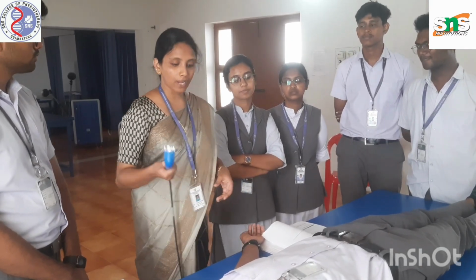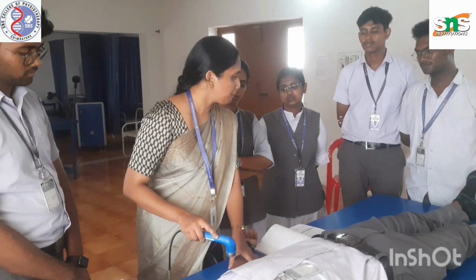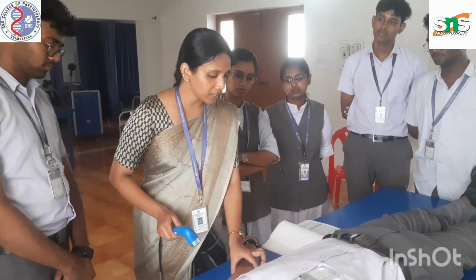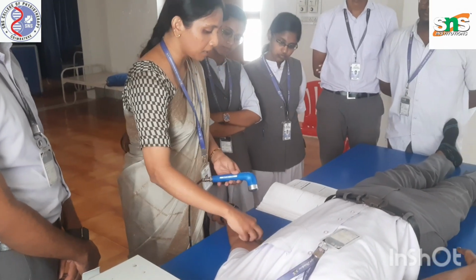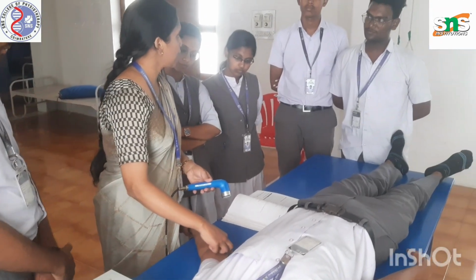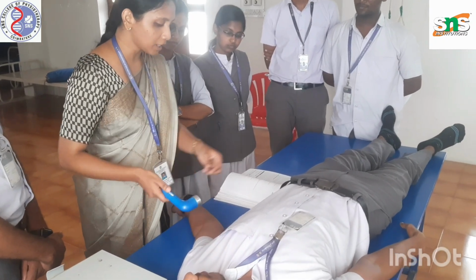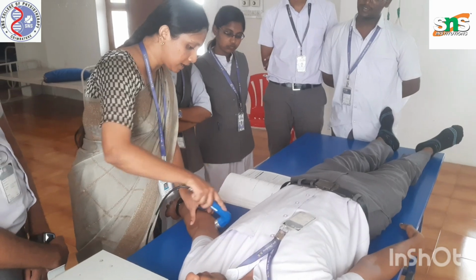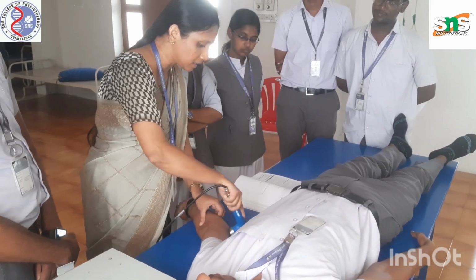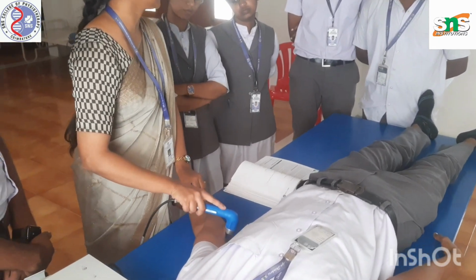For example, now I am going to tell you about medial epicondylitis. Medial epicondylitis is this bony projection. This can be commonly inflamed in sportspersons and homemakers. For that you have to apply a coupling media and you can do concentric circles continuously over the medial epicondyle for about 10 to 15 minutes.